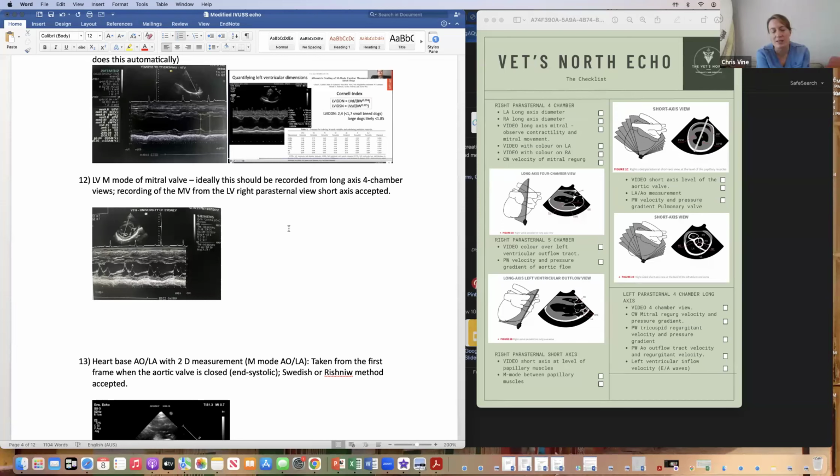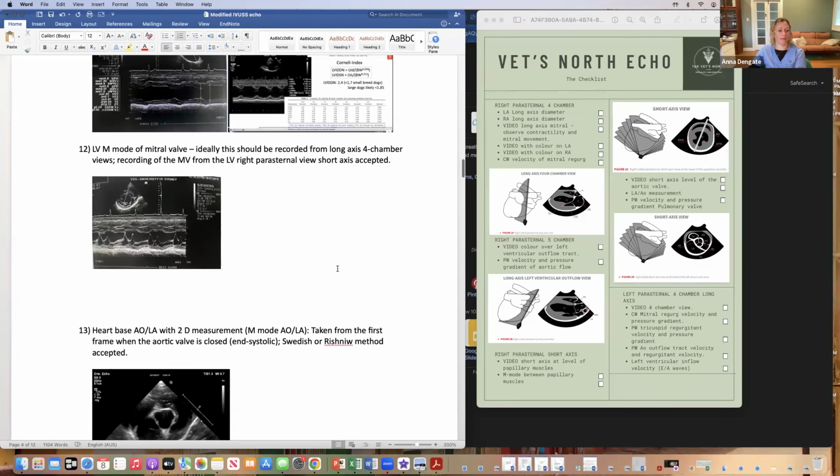One thing I did notice when they have examples of good case reports on that website, and the case reports that they've got there for the echoes, a lot of people have done the short axis with the fish mouth view to show that the valve looked normal. So get a few of those in there as well. Yeah, okay. It's not actually something that we need to report on and put a number to, but it's nice to document. Yeah. Okay. Good. We can start taking pictures of that.